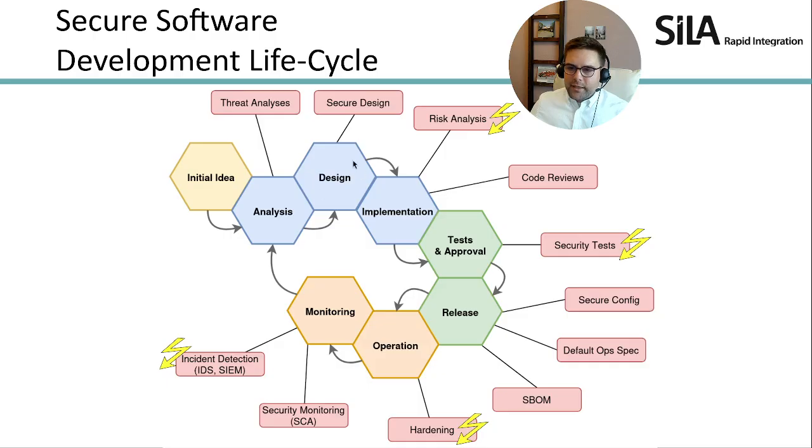So in the design phase, we need to think about these requirements as well. All the requirements that are about resilience, about the software being robust against poisoning, being robust against changes, also being robust against human errors, because this is what's happening a lot more often than the malicious intent. Somebody just disabling a calibration because he needed it at some point, forgetting to re-enable it, changing a method. The method is not stored in some kind of version audit trail way, so the changes are not detected. We need to think about these things in the design phase as well.